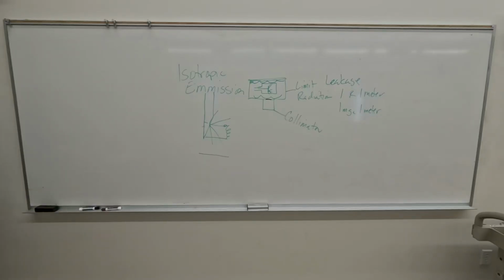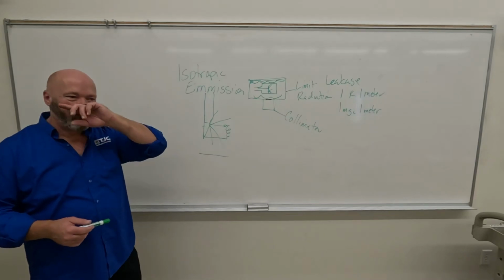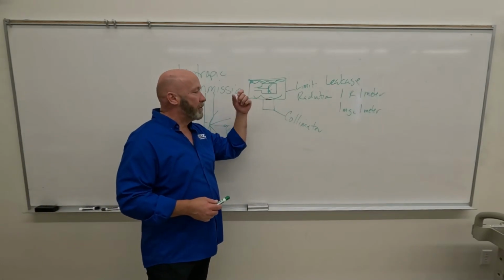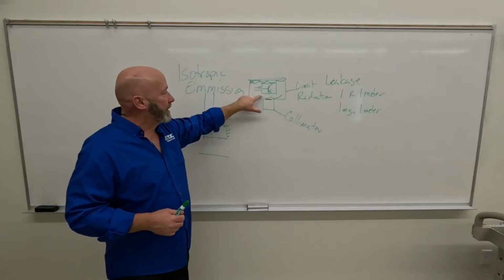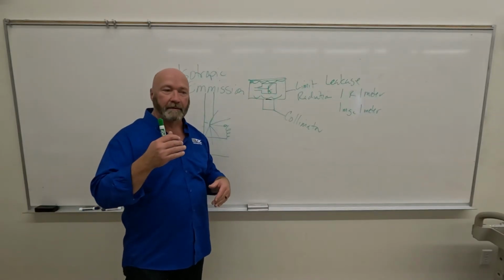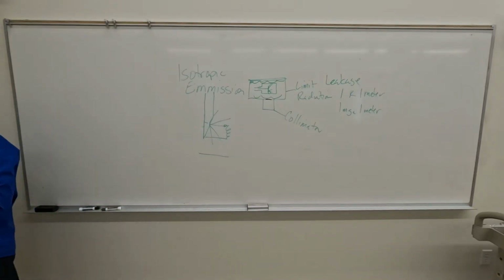Okay, so metal tubes. We'll talk about why we make the change to metal tubes here in a bit, but just know for right now, hopefully we'll get to this today, that we've made a change in a lot of the X-ray tubes. The envelope is now metal instead of glass, and there are legitimate and good reasons for it. So we'll talk about the internal components of the X-ray tube, and that's what's been coming around.